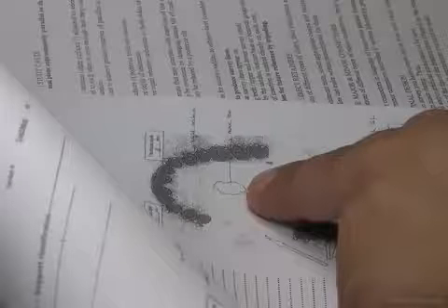Anterior posterior bar. Palatal strap. Palatal strap is in the middle. Anterior posterior palatal strap. Okay. Or anterior posterior palatal bar. Okay. But what is the contraindication of a posterior component of the palatal? If the tori is larger than the vibrating line posteriorly, I cannot. Okay? So I'm left with the horseshoe design.